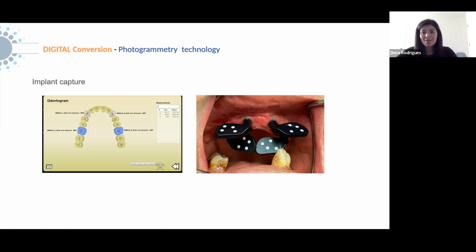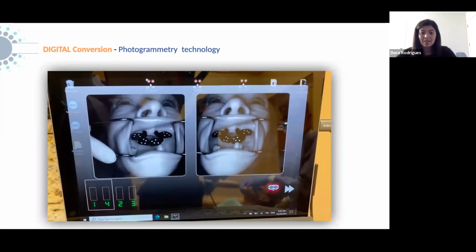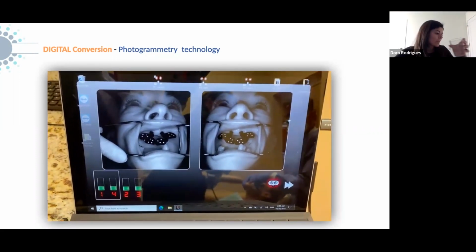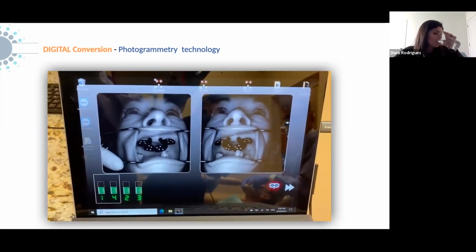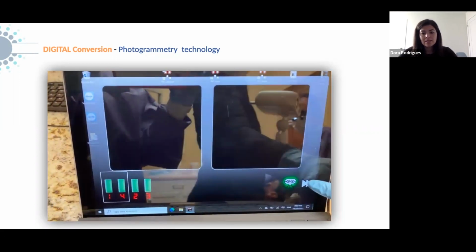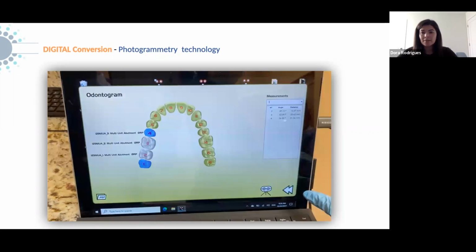And this is in speed. It actually takes longer to place the flags and orient them in the mouth than to actually have that data. And this is how quick it is scanning the implant position. And that's it. So it's really quick, very precise. So for the digital conversion, for this type of technology, we will need the passivity of the implants that scan.